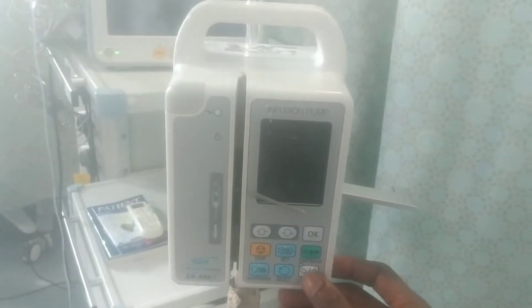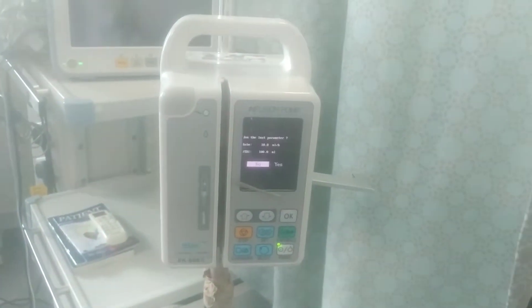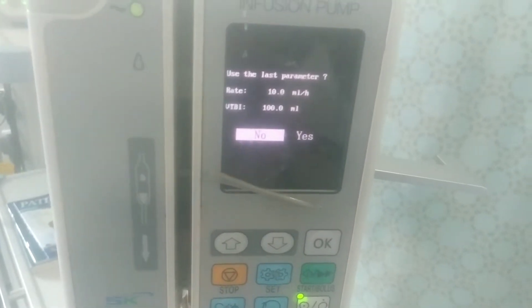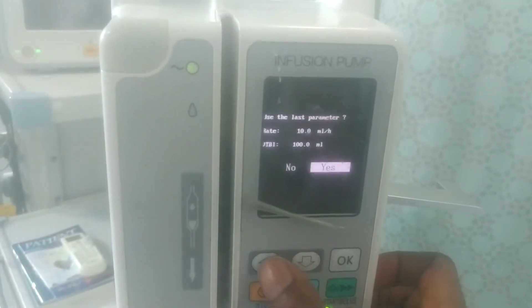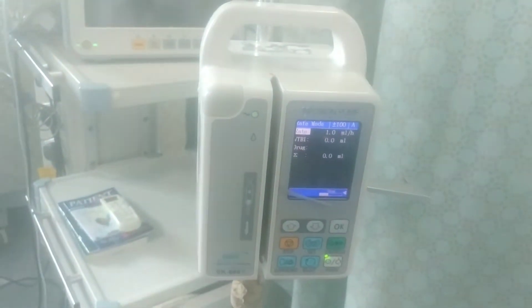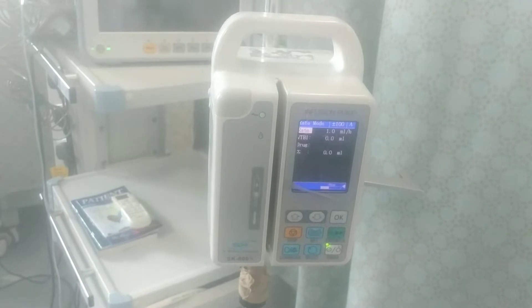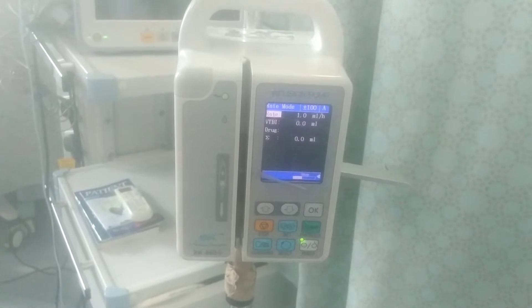This is the power button. You press on it to turn on the infusion pump. Once it's on, you can see on the screen it says 'use last parameters.' You can decide to say yes or no. If you were running an infusion on a patient and the power went off, when it comes back on you can choose yes to continue from where it stopped, so that you don't miss your count or timing.